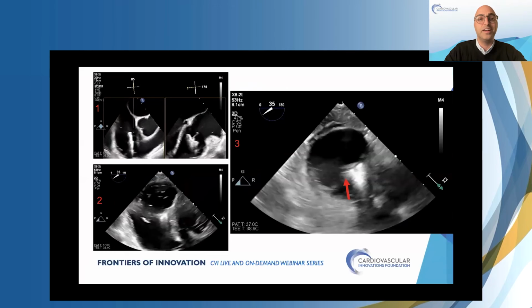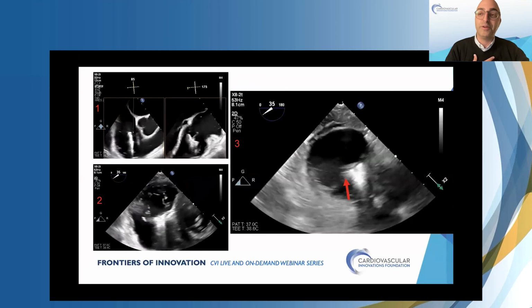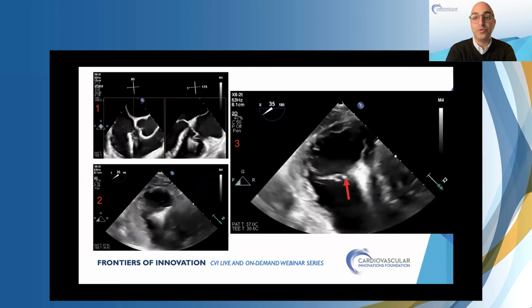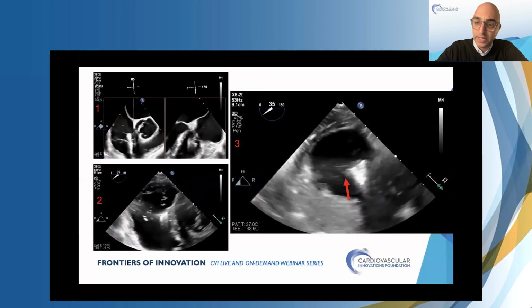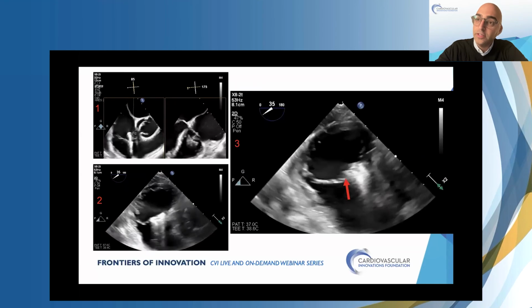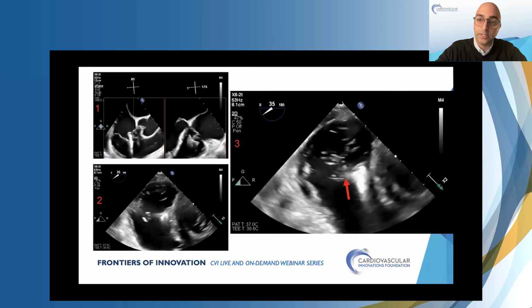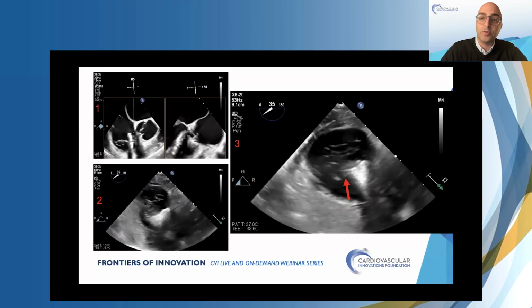So now we're advancing in an X-plane, and we love to grasp with transgastric. I know everyone doesn't like that, but we love transgastric, as Gagan knows. So we're in transgastric in image 2, and in image 3 here, we've actually grasped. And as we grasp, the arrow is pointing out the anterior leaflet, because the anterior leaflet has way too much mobility, and it is not falling into the middle of the clip. So if you read a lot of the papers from Europe, they've published really early on about transgastric grasping, the importance of it, and this is one that probably is not optimal.